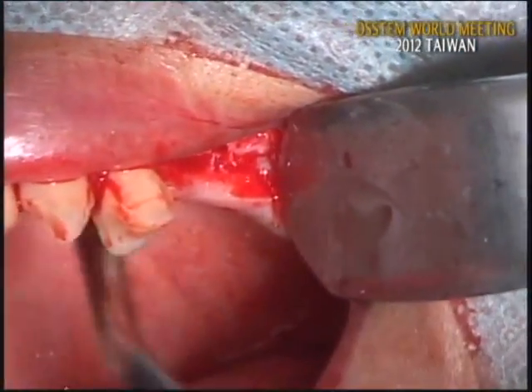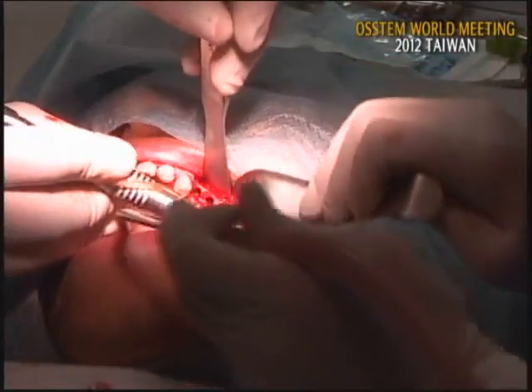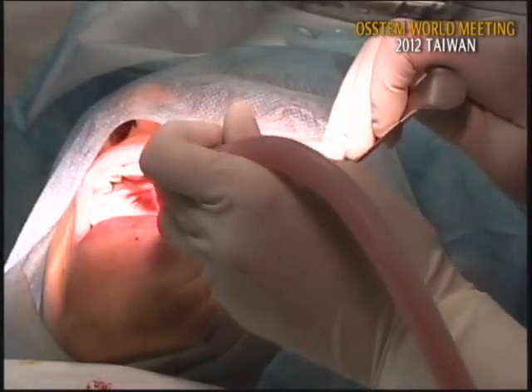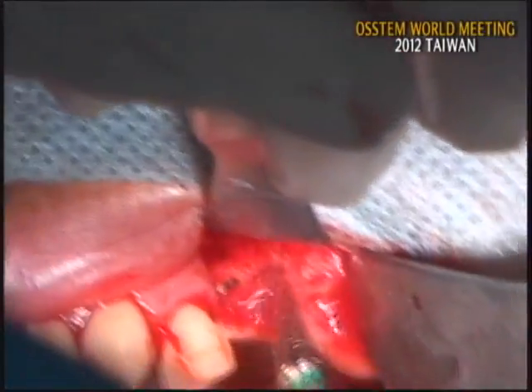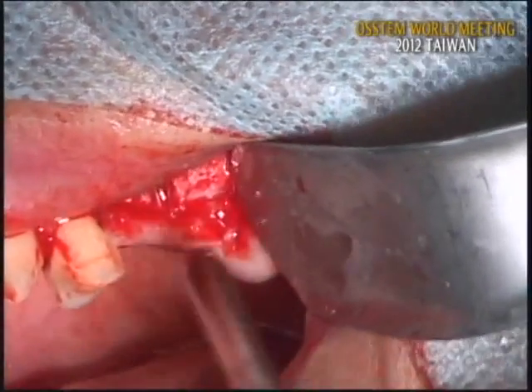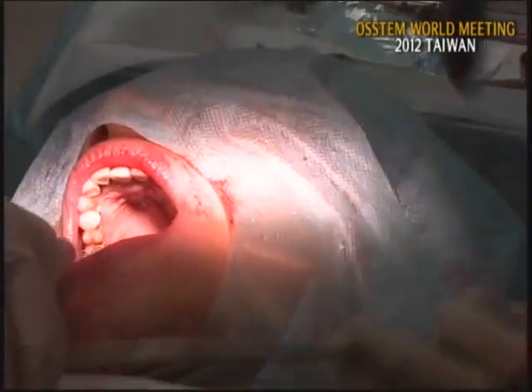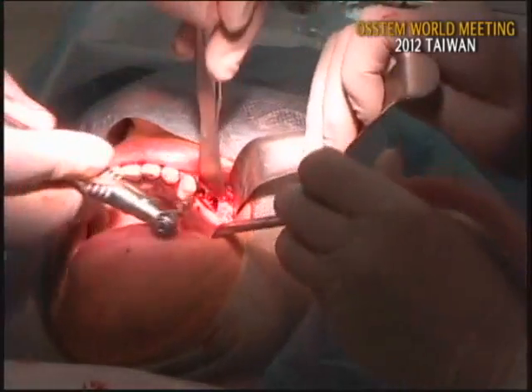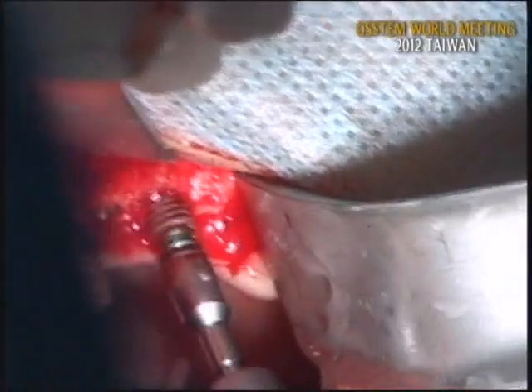Well, you may worry about the initial stability if I change the position. Let me try. If the torque is not so good, I'll submerge the fixture. Okay, let's try. I place again, to slide lingually and distally. How about torque?